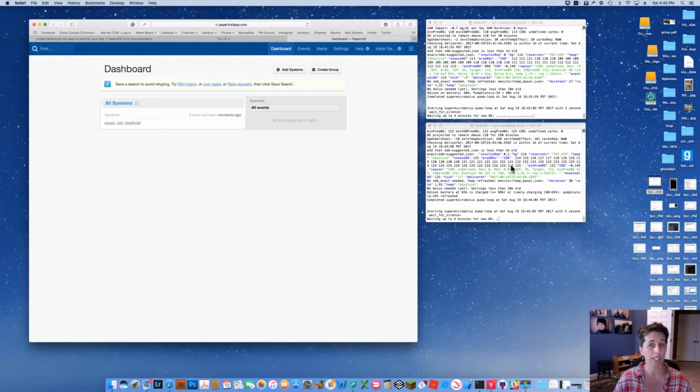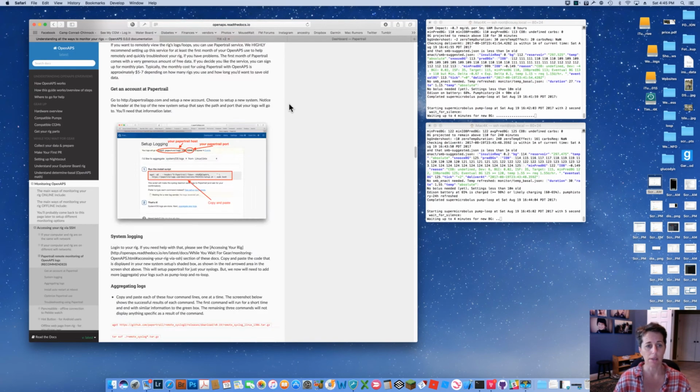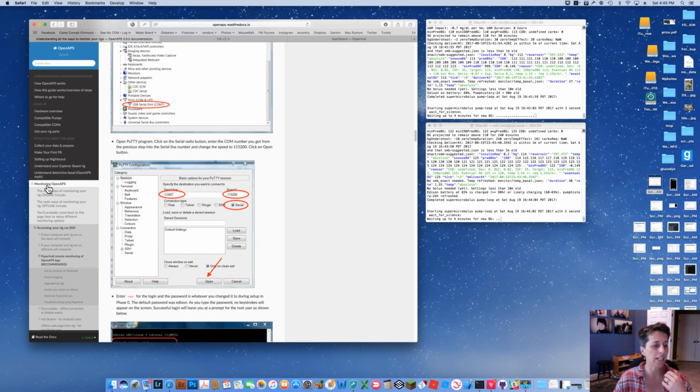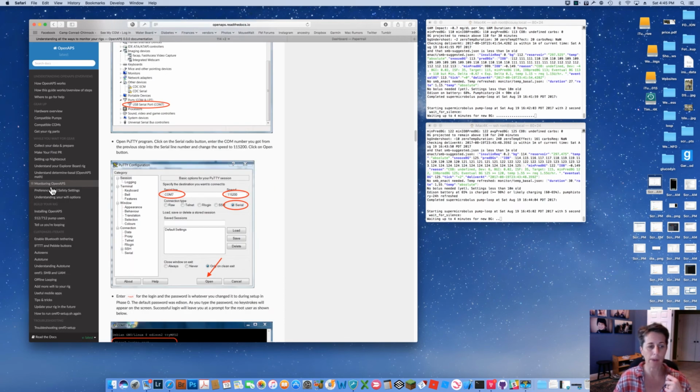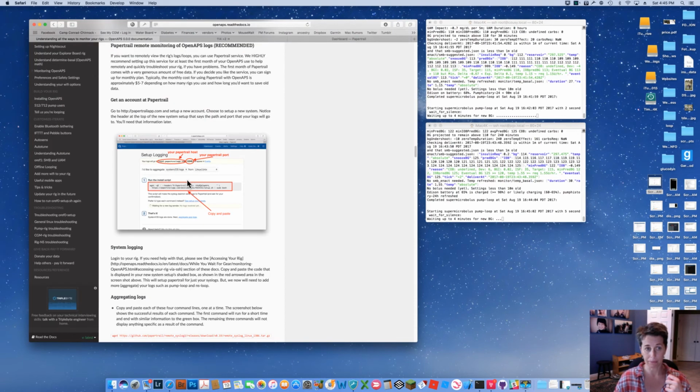But I also have set up Papertrail on these two rigs. And so I wanted you to take a look at setting up Papertrail and how you use it on yours. Basically, the directions for setting up Papertrail are under the Monitoring OpenAPS section. If you go to that section, it'll have a link to the Papertrail setup. You can click on that, and it will take you into how to set up Papertrail on your rigs.